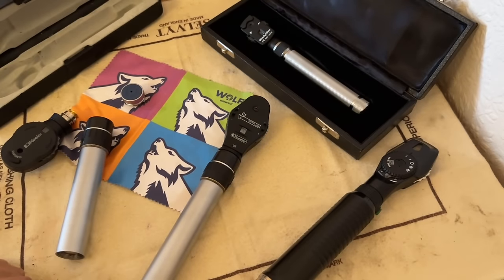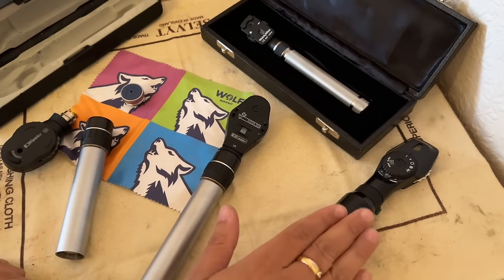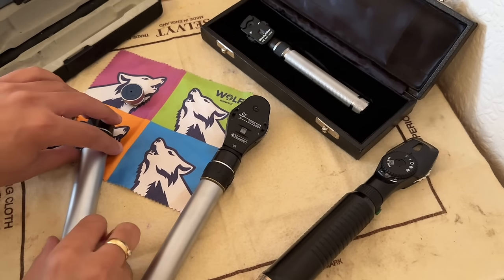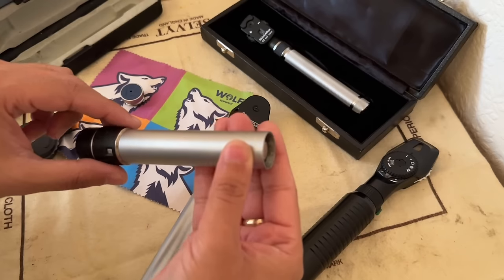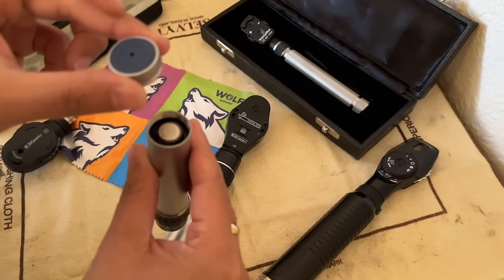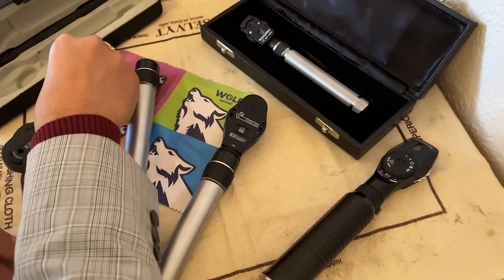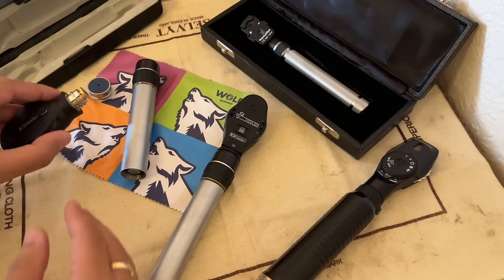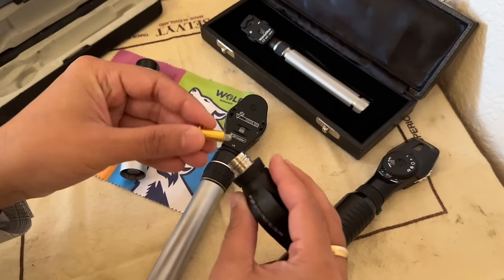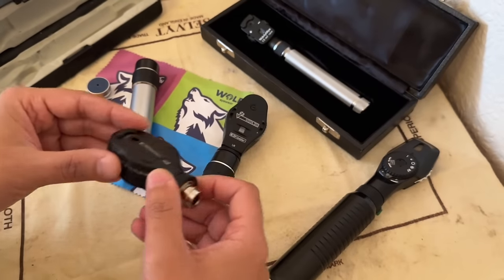Let's have a little look at the ophthalmoscope. We have a range of four here: the Welsh Allen pocket ophthalmoscope, the Knights one, and a couple of Keeler models. Looking at this one here which I've taken apart, we have your power source, your battery or batteries, the screw cap, and the charging portal if you're using a rechargeable battery. In the head of the ophthalmoscope is where you'll find the bulb. So that's how they're put together.